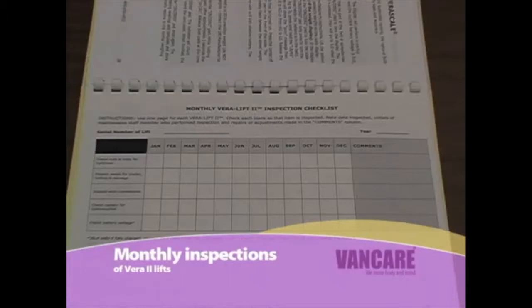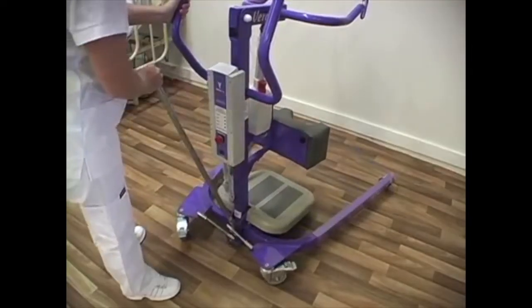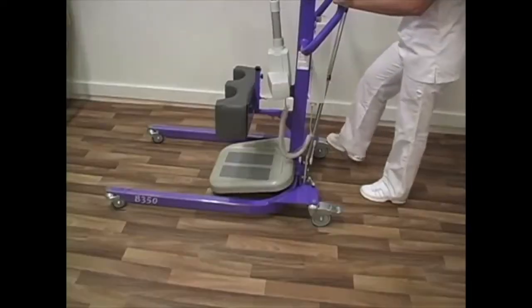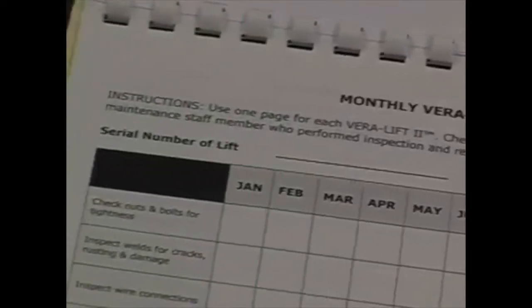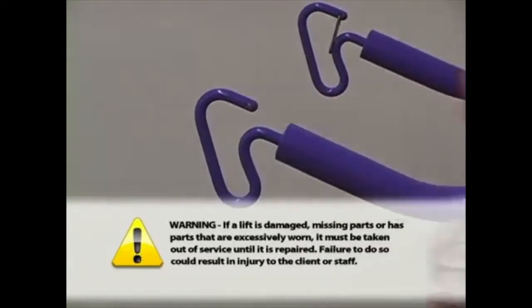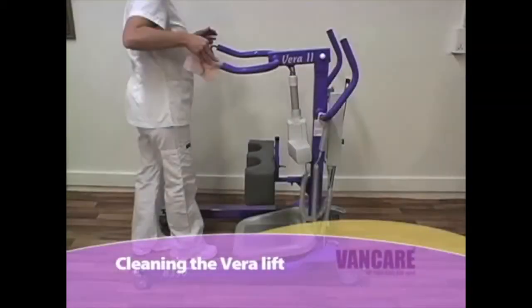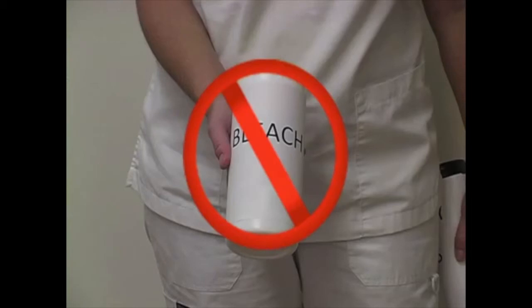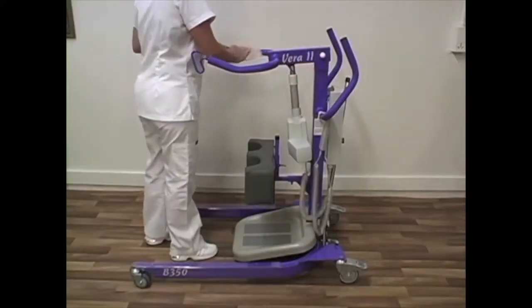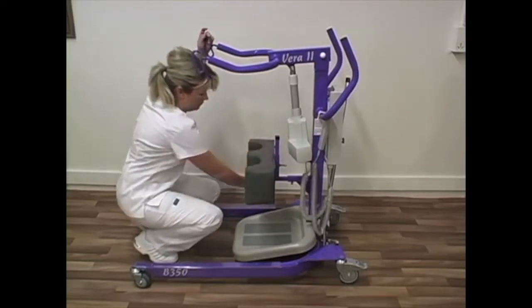Monthly inspections of Vera 2 lift: Qualified maintenance staff are required to inspect all VanCare lifts at least monthly for missing parts and excessive wear that might cause the lift to fail. A permanent record of each of these inspections and repairs should be kept by the facility. See the monthly Vera 2 inspection checklist at the back of the Vera 2 operations manual or contact your distributor for a copy. Warning: If a lift is damaged, missing parts, or has parts that are excessively worn, it must be taken out of service until it is repaired. Failure to do so could result in injury to the client or staff. Cleaning the Vera Lift 2: When soiled, it may be wiped clean with a damp sanitary wipe. Do not use bleach. The Vera Lift 2 should never be cleaned in a shower as water can damage the electronics. Damage caused by failure to follow this cleaning procedure is not covered under the warranty.